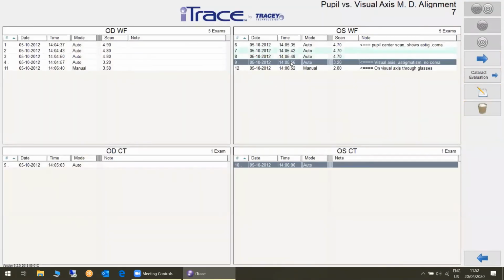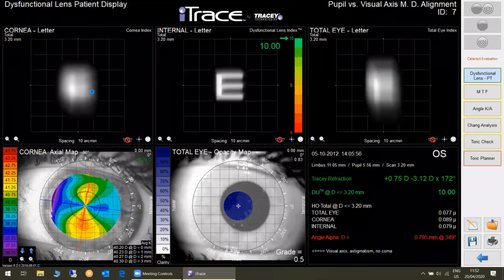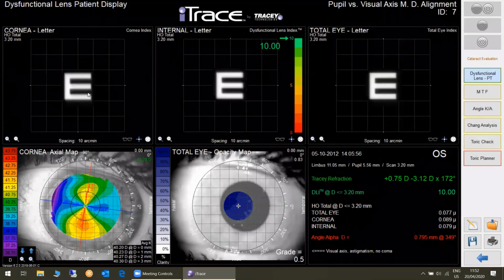Okay, let's imagine that this guy comes to your studio. He's 50 years old like me, he has no cataract, but he wants to get rid of these reading glasses. So you do a cataract evaluation, and you say, no cataract. You ask him, would you like to see like this, or would you like to see like this? 100% sure that toric is sold.